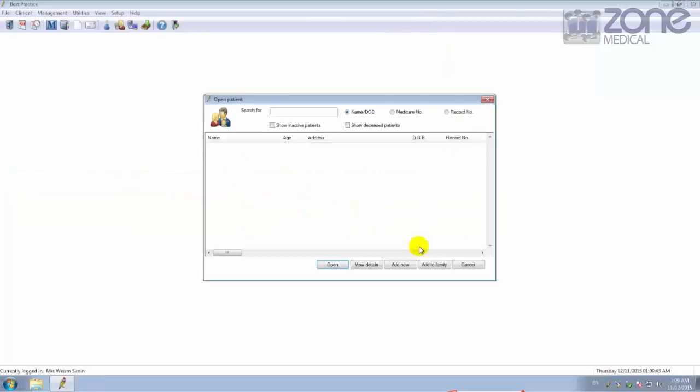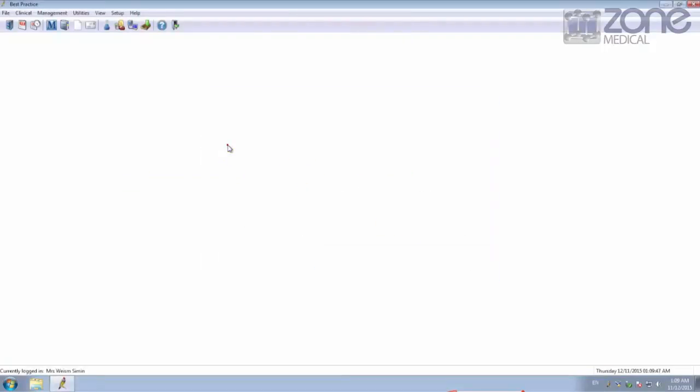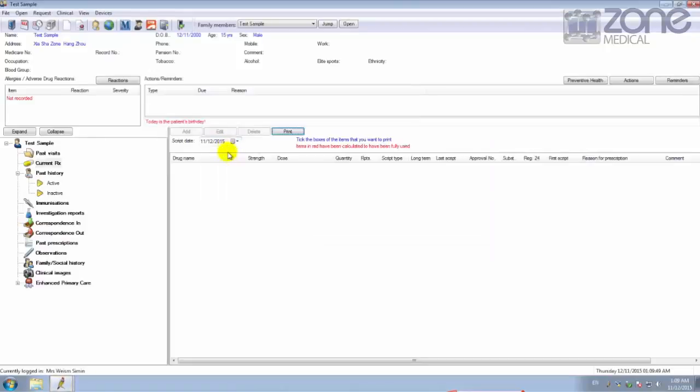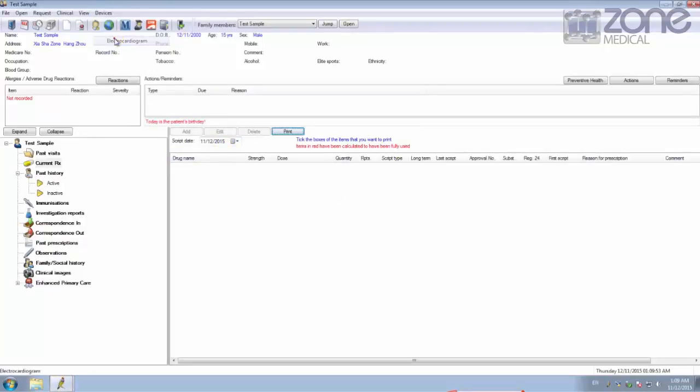If you choose to start in Patient Files, you can immediately choose a patient and open up their patient profile. From here you can run a test by clicking Device and then clicking Electrocardiogram.